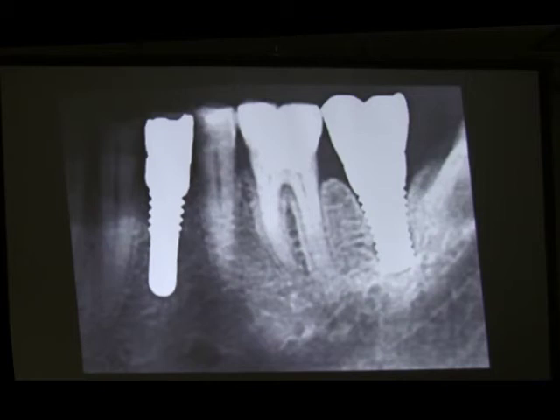Yeah. I mean, this is the protocol that we do, but the more experienced you are, I agree with you, and the more you have restored titanium implants and you have cemented and you have seen what happens when you cement subgingivally. Well, I've got several articles published on this particular technique. Exactly. It's a technique-sensitive procedure, but it can be done with this implant. Your implant design is beautiful for that. Yeah. The only thing is that when you place a crown and one day you have a longer gum recession on the implant, and you did a crown, you cannot go back.